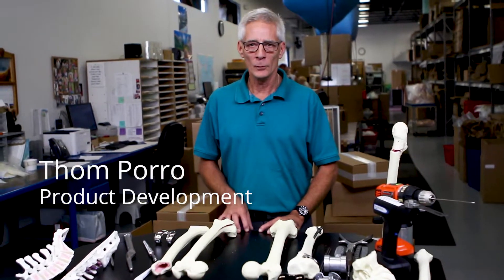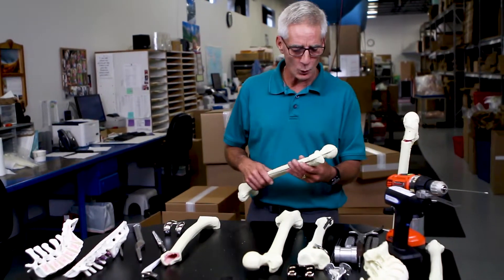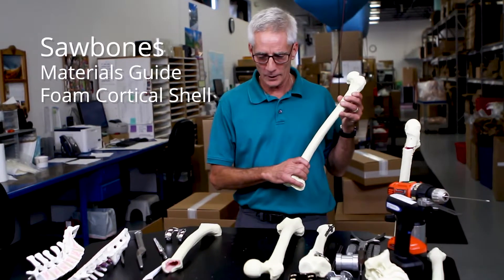Hi, my name is Tom. I'm with the new product development team here at Sawbones. And today we're going to talk about the foam cortical shell models that we offer in our product line.